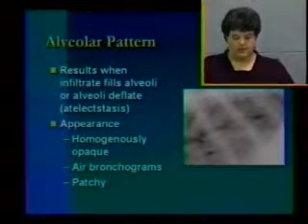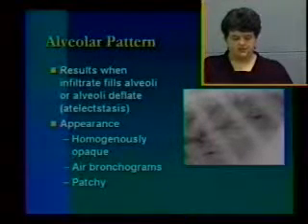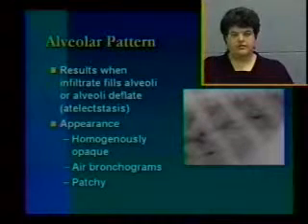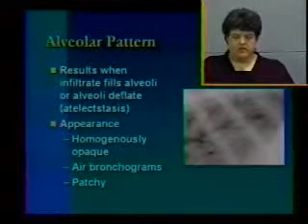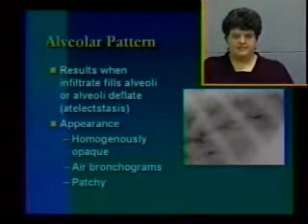Alveolar pattern is probably the easiest to identify and probably has the shortest list of differentials. An alveolar pattern results when infiltrate, either fluid or cells, fills the alveoli or air sacs. Or it can occur, like we've discussed earlier, if the alveoli deflate and there's atelectasis.